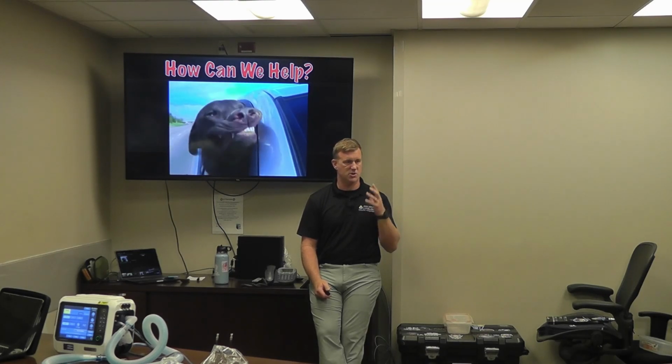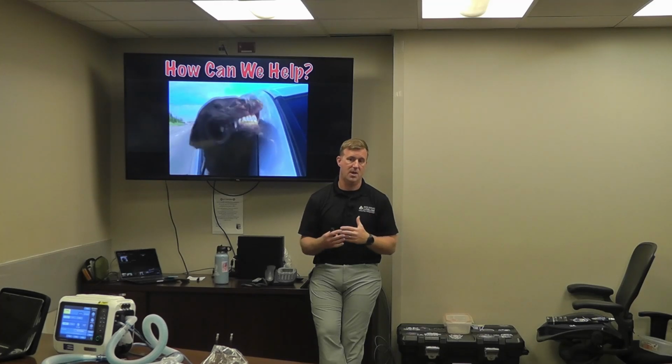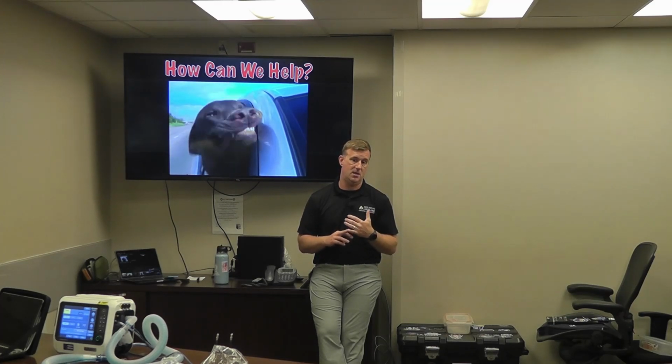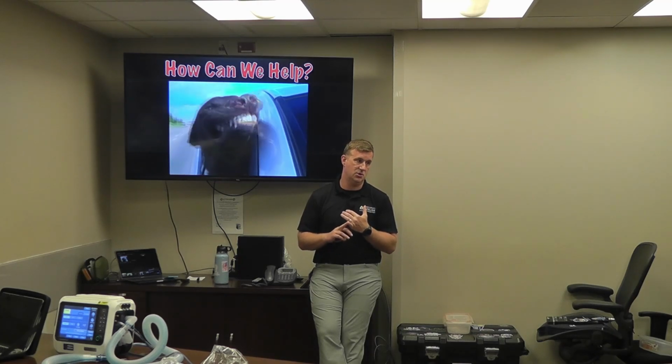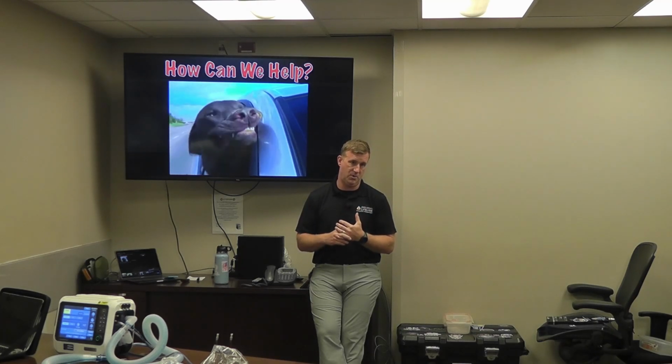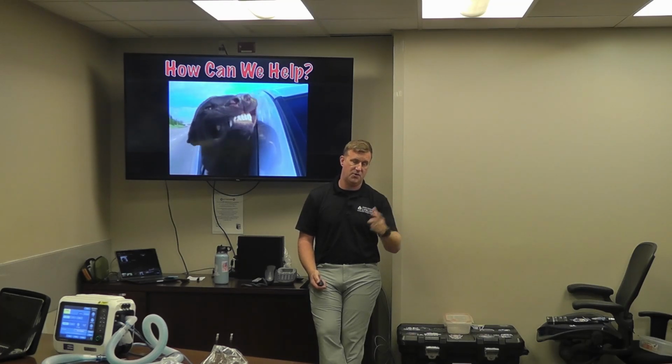You try non-invasive and they're just so uncomfortable with it, they're yanking it off, they're super, super uncomfortable. That may be because they don't know what's coming and they're not willing to sort of deal with it. We haven't coached them through it. Additionally, it can come down to some settings on the ventilator, and we're going to talk through this.